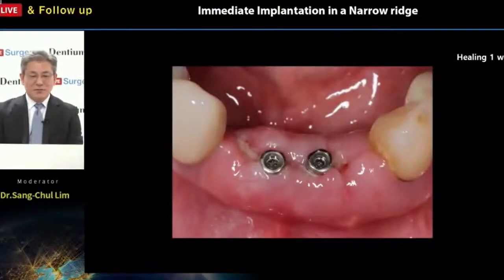And at the 1 week healing, the faster healing situation was seen. As I mentioned before, you can remember that the main effect of this collagen graft tool is faster tissue healing, especially faster epithelialization, inducing faster epithelial cell migration. So in just 1 week, all the surgery areas were closed and healed very well.